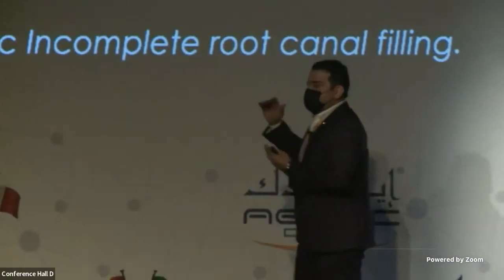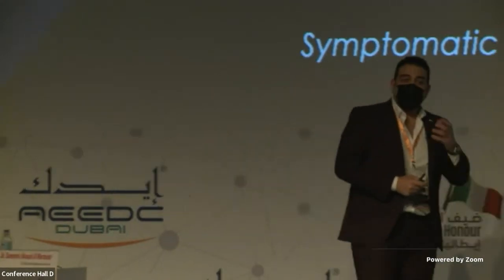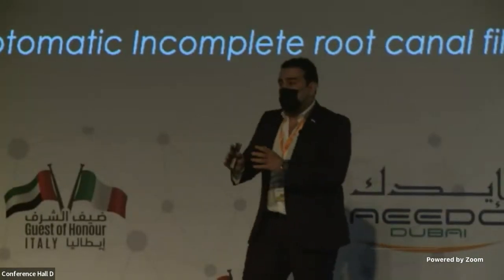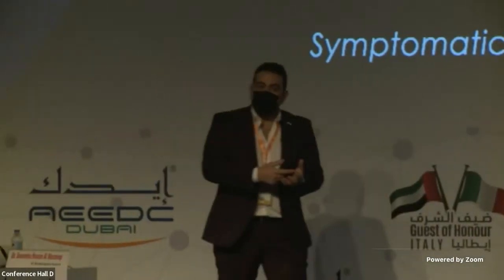So we have some clinical signs and radiographic interpretation to know if our case has failed. Maybe if the patient has symptoms, pain, swelling, sinus tract, we can identify that we have failure. And from the radiograph, if we can see a radiolucency which is increasing in size, we know that this is a failure.